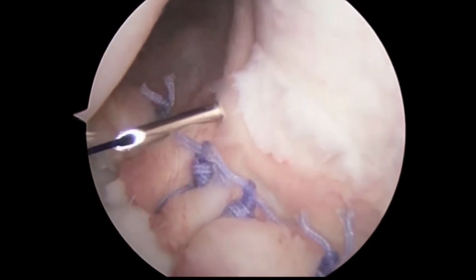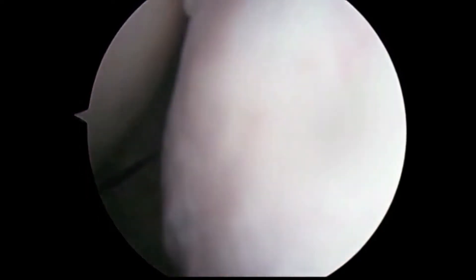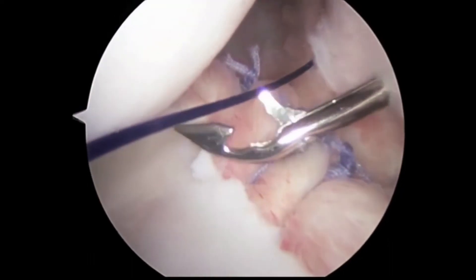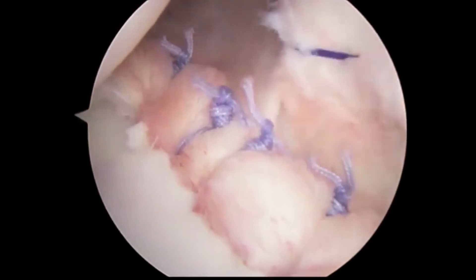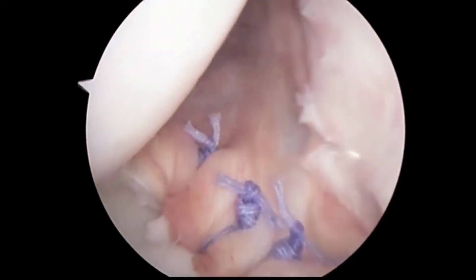This is done by again putting a suture through the tissue, grasping it, and then passing another suture to secure it. Here we see the final result.